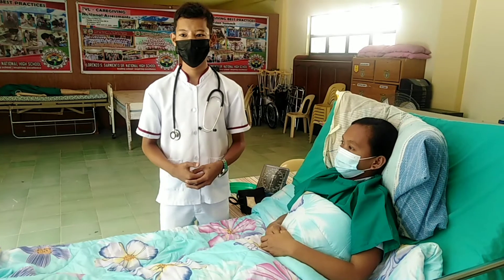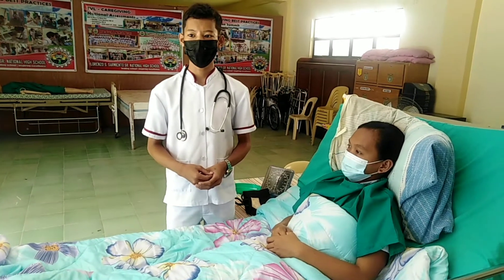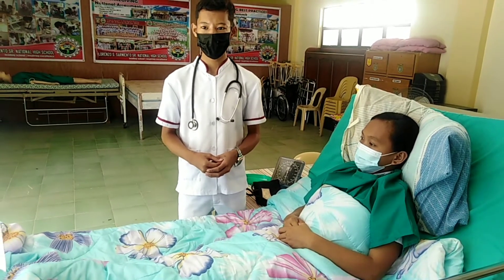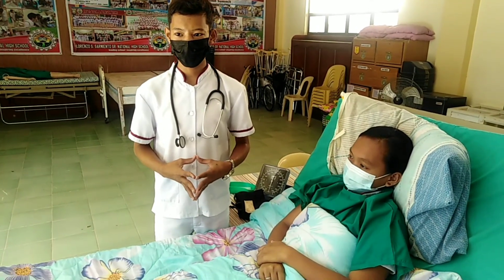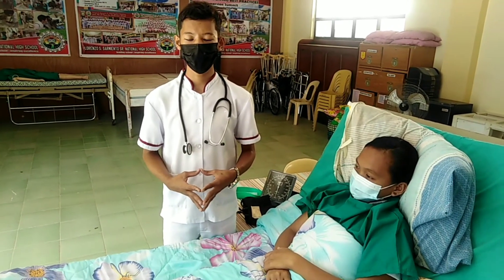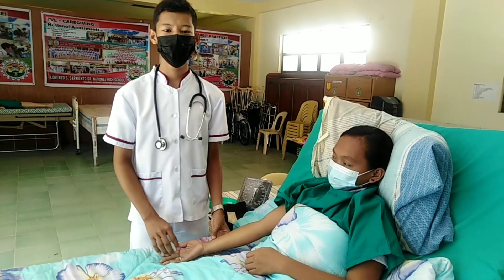Have the client rest at least five minutes before measurement. Determine the previous baseline blood pressure if available from the client's record. Identify factors likely to interfere with accuracy of blood pressure measurement, such as exercise, coffee, and smoking. Assist the client to a comfortable position. Be sure the room is warm, quiet, and relaxing. Support the selected arm and turn the palm upward. Remove any constricting clothing.